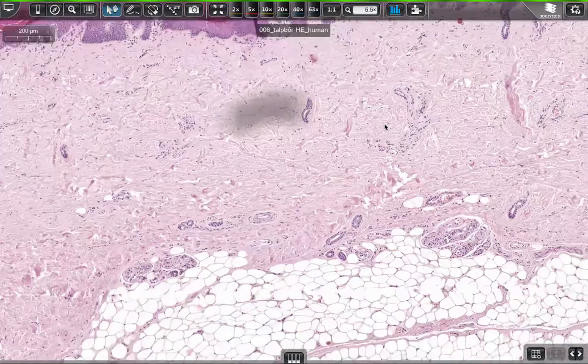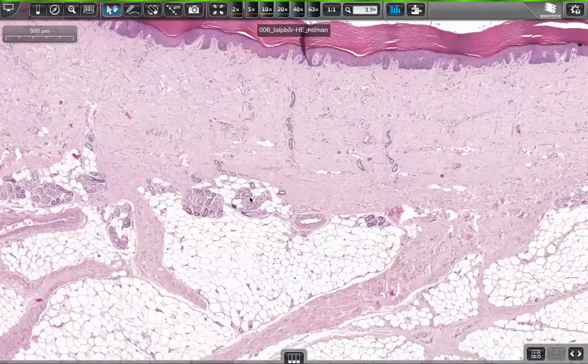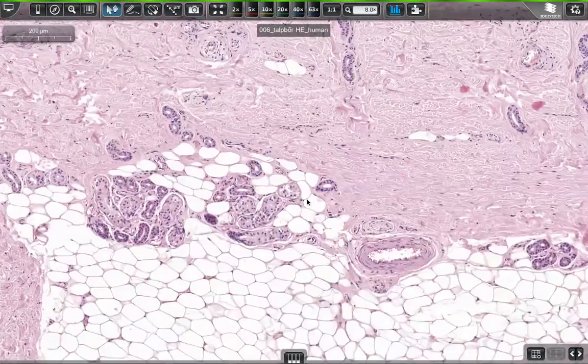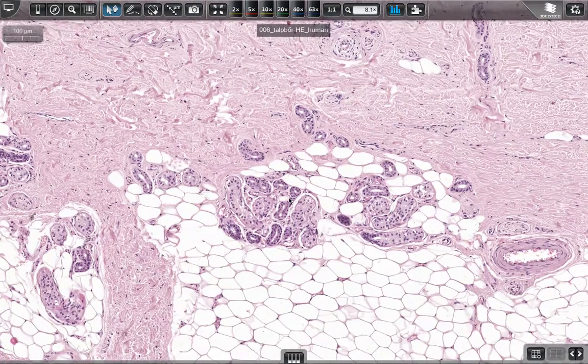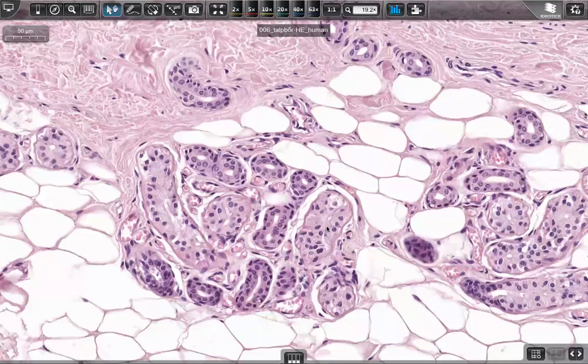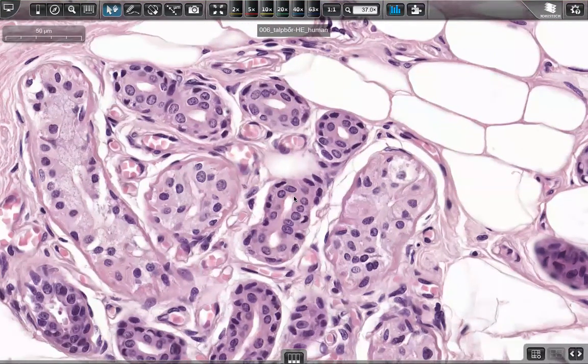So these are fibrocytes, and here we have the collagen fibers. And in the dermis, beautifully seen, these units. These are merocrine sweat glands. These are the excretory portion, and these are the, sorry, I mixed up. That's the duct, that's the secretory portion. So secretory, the paler one, and the two layers, the darkly stained, that's the duct.